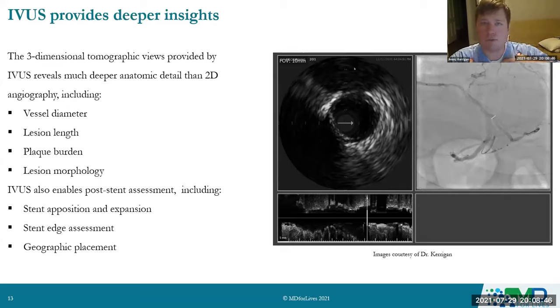We can talk about those reasons why in the conversation, but just to get a sense of where we start. And then hopefully as the night wears on, I can give evidence that potentially will change some practice with regards to how often you're using intravascular imaging and doing it before and after stent implantation. So I'm not sure if you guys can see the live answers. I see them coming in here.